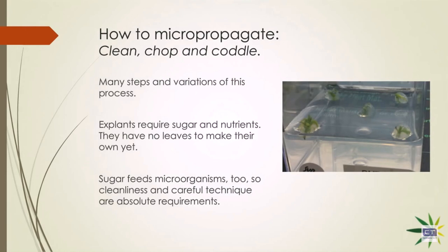But then there's all the other additives, sugar, the antimicrobials that you have to add. Sometimes some methods use plant growth regulators, those sorts of things. That's where the mixing comes. Generally, the standard salt mixtures, there are so many different varieties of them. There's not much invention there, although in large-scale operation, there is tweaking because certain minor constituents might want to be tweaked to optimize the process. But that's something that happens as you go along and as you scale. The generic formulas, those are well known and can be found by anyone with some Google skills.